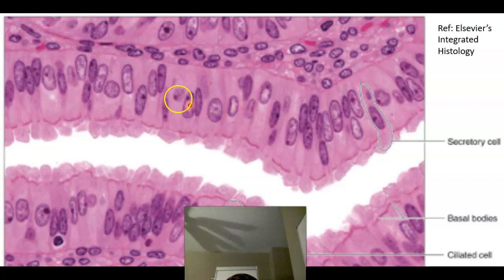Some of the cells in the lining of the fallopian tube are non-ciliated with a bulging upper apical surface. They have no cilia. They are mainly secretory in function. They secrete for the nutrition of the ovum and the spermatozoa, and they are called the PEG cells.